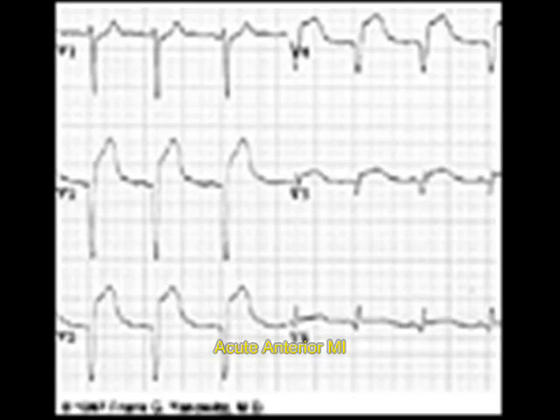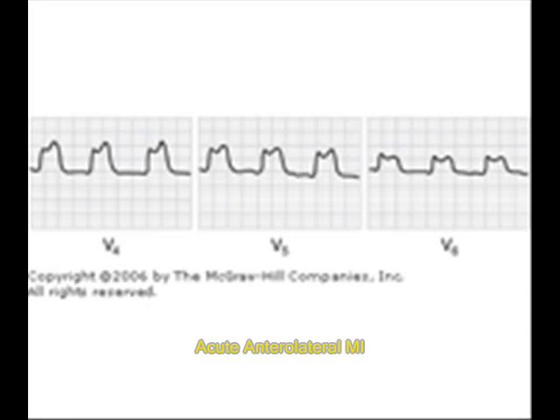Similarly, you can see here acute anterior MI. It is characterized by ST segment elevation, especially in V2 and V3. This is acute anterior MI. And if you see ST elevation in lateral leads like V4, V5, V6, it is acute anterolateral infarction. So in acute anterolateral infarction, you will see ST segment elevation in lateral leads V4, V5, V6.